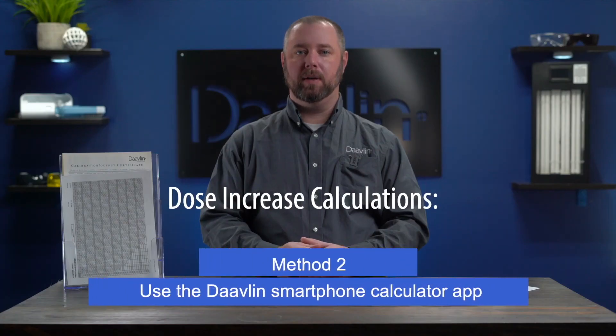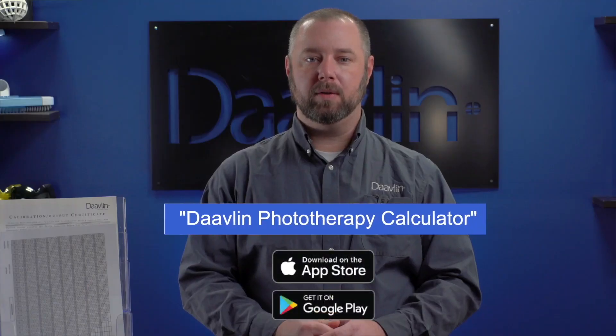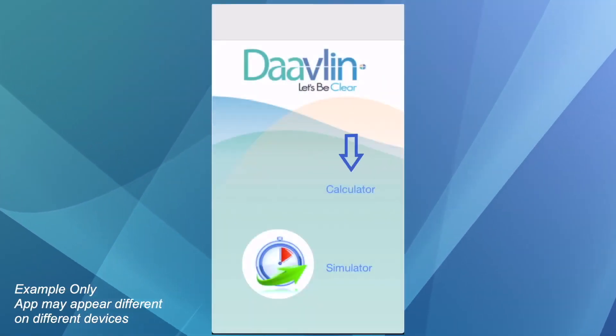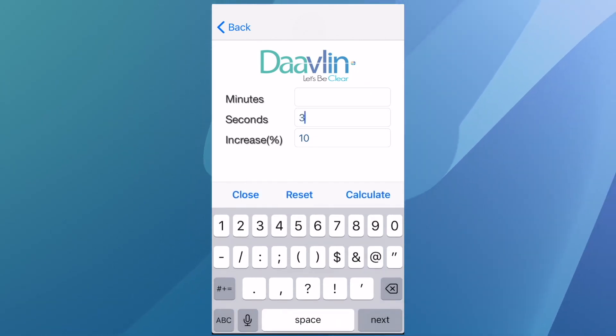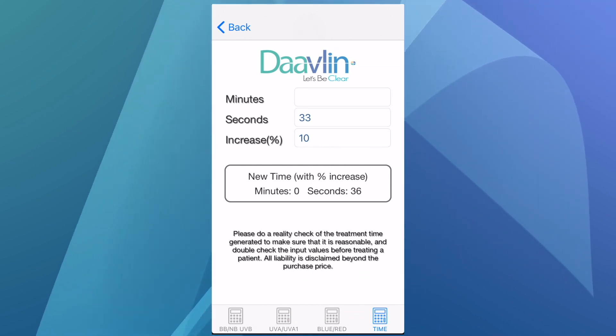The second way to calculate your next dose is by using the Davlin smartphone app. Open your smartphone's app store and search for Davlin Phototherapy Calculator. Once installed, open the app and tap Calculator, then tap the time tab at the top. Enter your last treatment time and the desired percent increase and tap Calculate. The app will generate your next treatment time. If your doctor has prescribed a maximum dose, say 2000 millijoules, you'll need to make sure that you don't exceed that maximum dose.